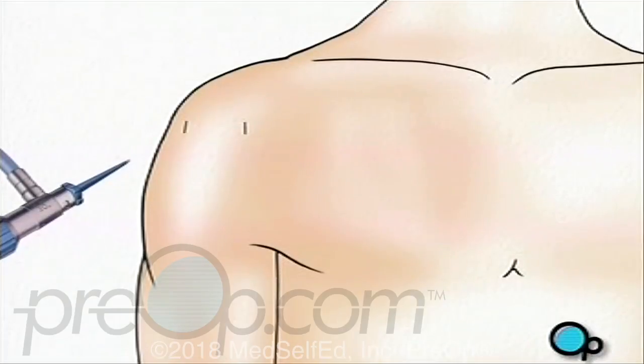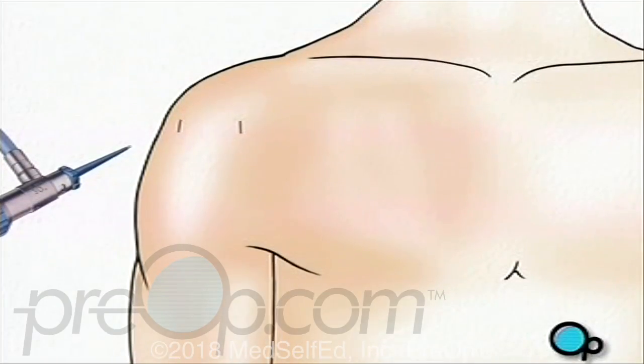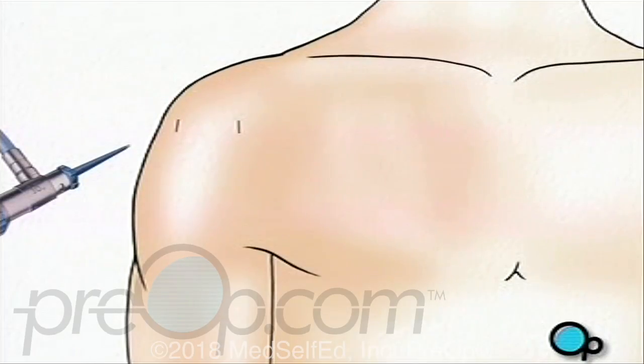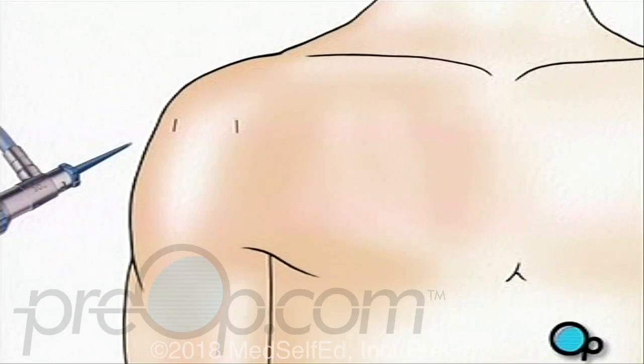Before your doctor can insert the arthroscope, the surgical team will inject a clear fluid into the joint. This fluid will inflate the interior space around the surgical site and will help your doctor by providing an unobstructed view and enough room in which to work.